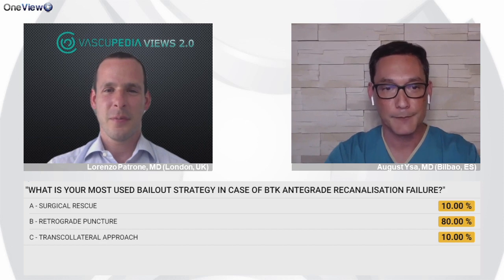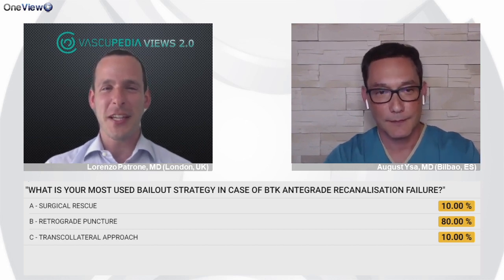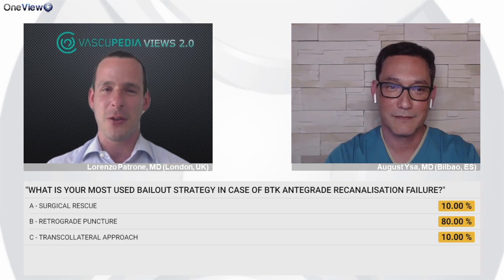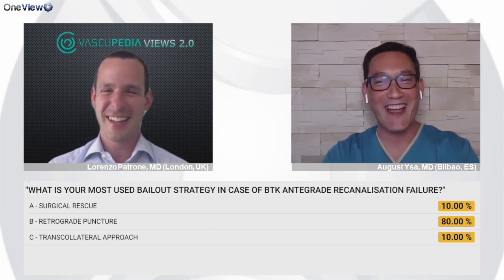Yeah. Perfect. And I would also like you to comment on safety, because sometimes people, especially in the UK, say the retrograde access is not safe. But do you think it's safer to go retrograde, puncturing a potential landing zone for a bypass in a sheathless way with just a CXI, or to dissect the artery antegrade into the dorsalis pedis, risking losing all the branches of the foot arch? What do you think is the correct answer? No, well, you know my answer.